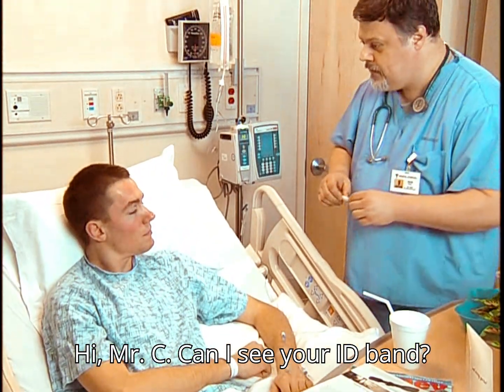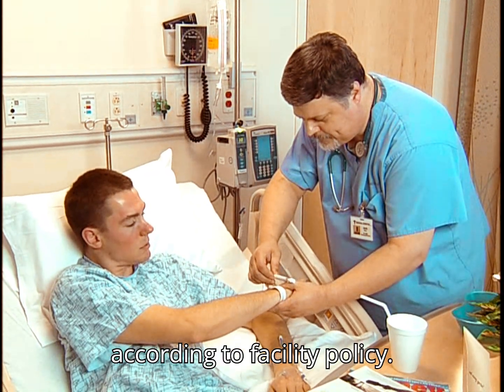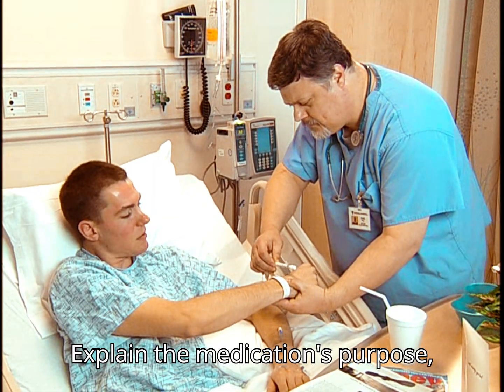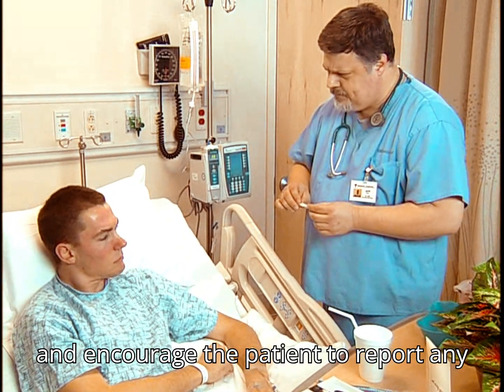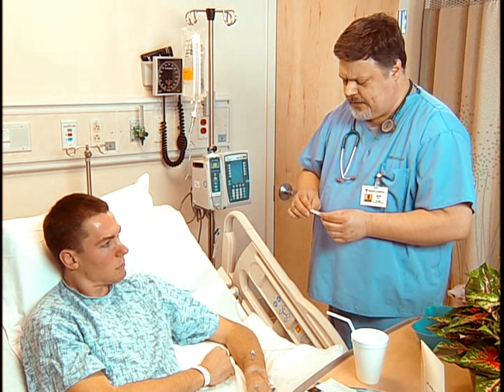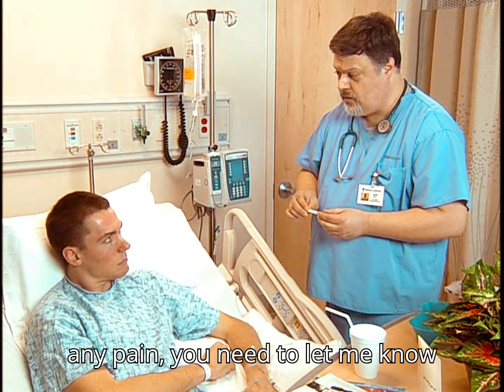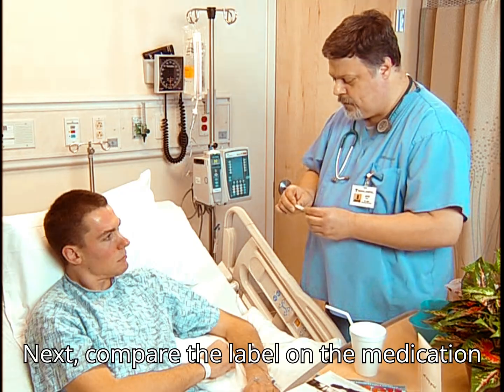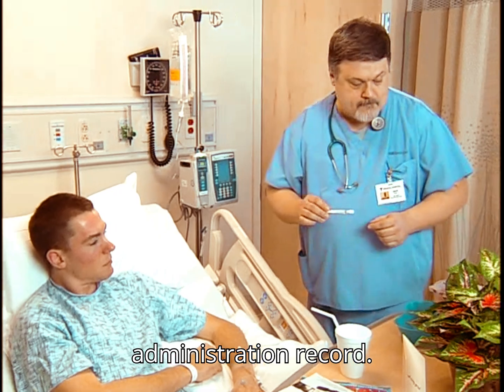Verify the patient's identity according to facility policy, then explain the medication's purpose, side effects, and administration route, and encourage the patient to report any discomfort at the IV site. If you have any problems, any discomfort, any pain, you need to let me know immediately. Next, compare the label on the medication syringe against the medication administration record.